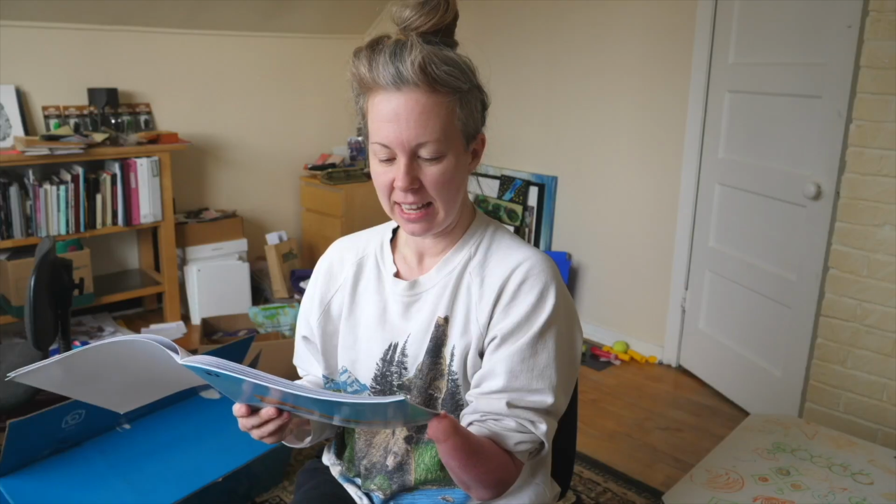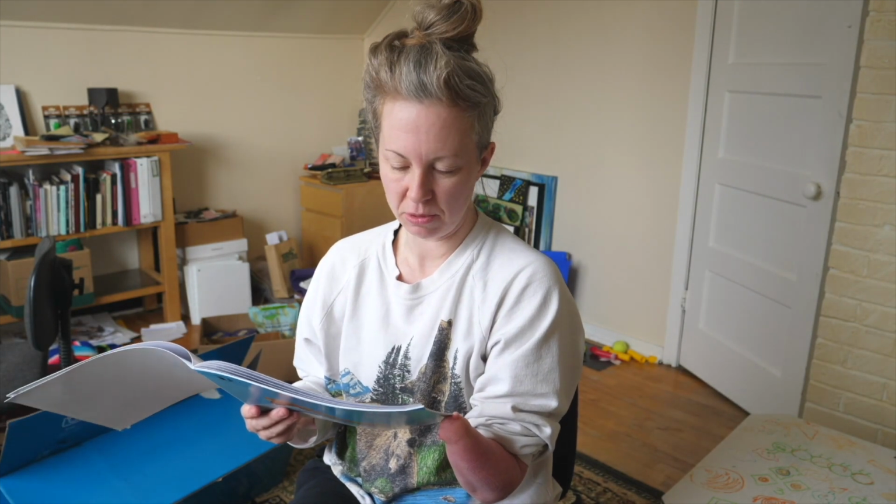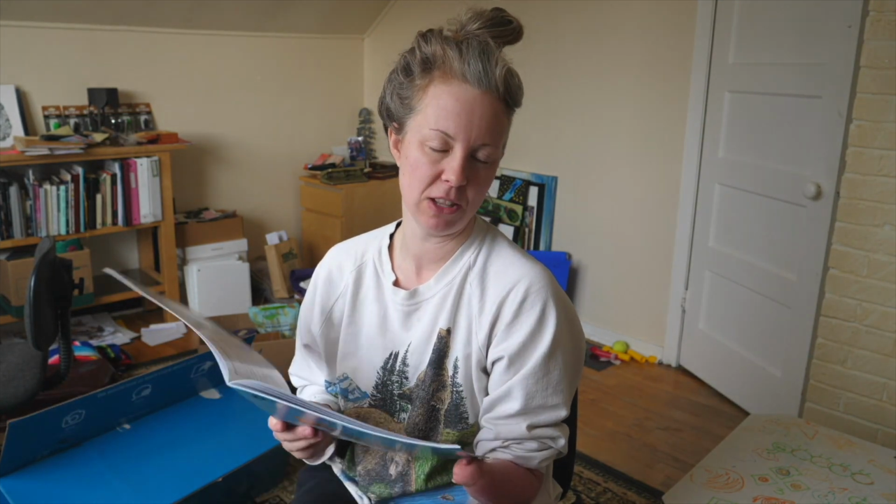Now I'm just gonna quickly tell you a little bit about limb care and hygiene. Daily washing of the residual limb. I don't like that word, so I'm gonna insert stump for that word. And the team has been mostly really good about it. I'm just like, I like stump. And they're like, okay, we'll say stump. Sometimes they forget, but I remind them.